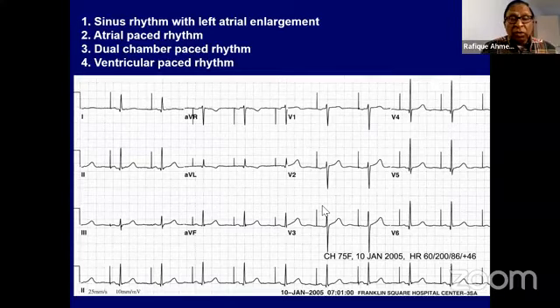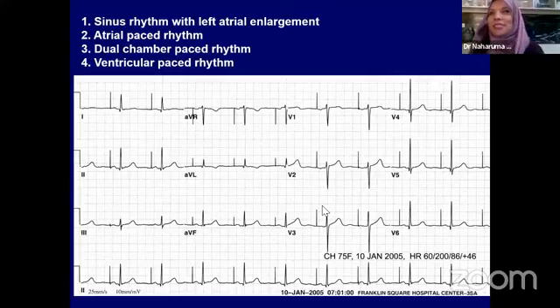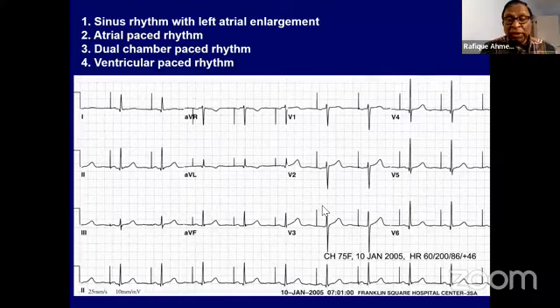Yes. So while they're doing it, Naruma, there is a question from Dr. Manoj Koirala. RBBB due to conduction defect versus RBBB due to atrial septal defect. Is there any difference? In ASD, it is due to the stretching effect from volume overload. And when the pathology is in the right bundle branch itself, the physiology will be different, but the findings on ECG are the same. So we'll have to look at right axis, left axis, and clinical features, right?